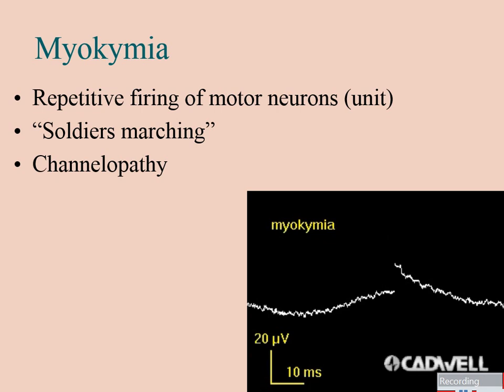You can have autoimmune diseases that are affecting ion channels in the axon. Or it can be arising centrally, where you've got like a potassium channel that's not buffering potassium like it should up there, and the motor neurons become hyperexcitable, and you get groups of them then firing together. So you get groups of motor units firing together, and this kind of EMG picture.